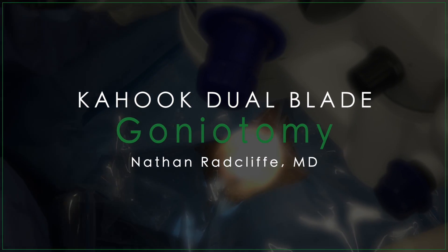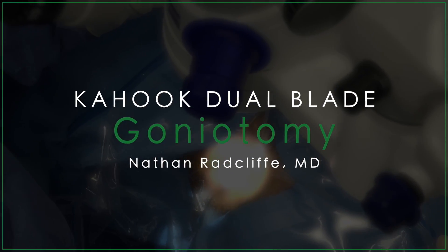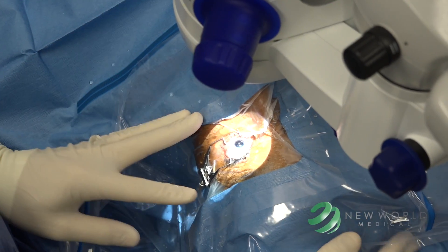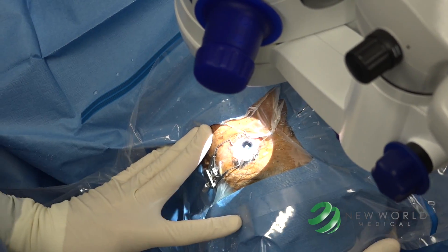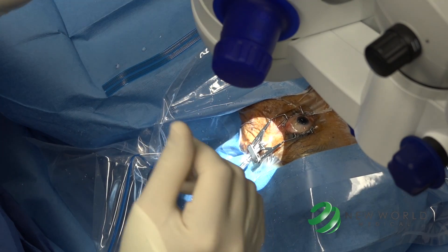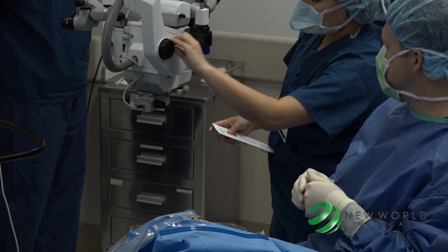Here I am in the operating room. We have completed a cataract surgery with implantation of an intraocular lens and I'm positioning the head. I will rotate the head itself about 30 or 35 degrees away from me and tilt the scope towards me.